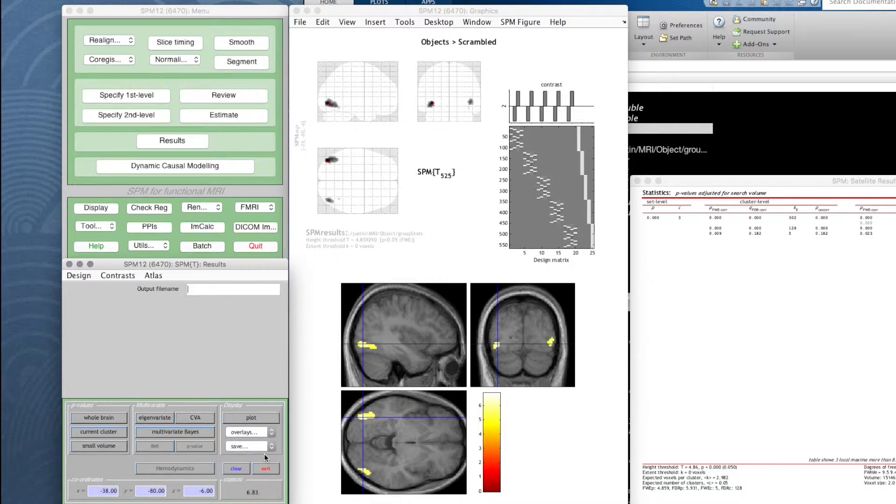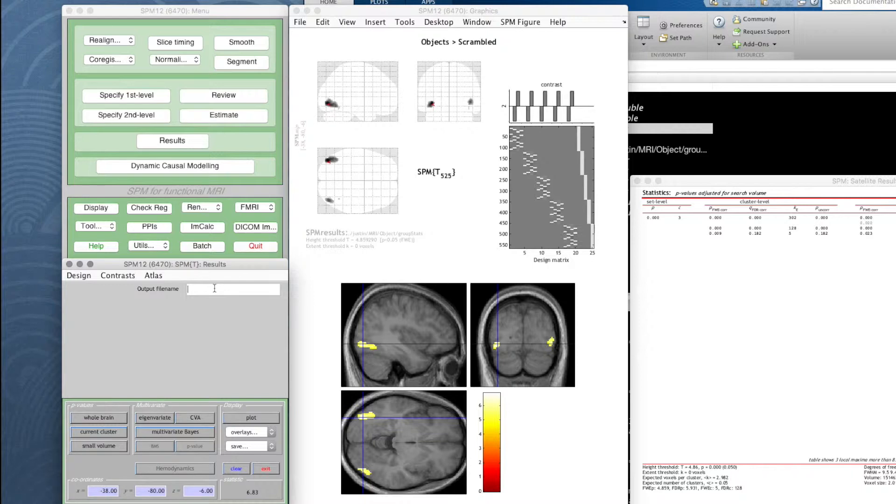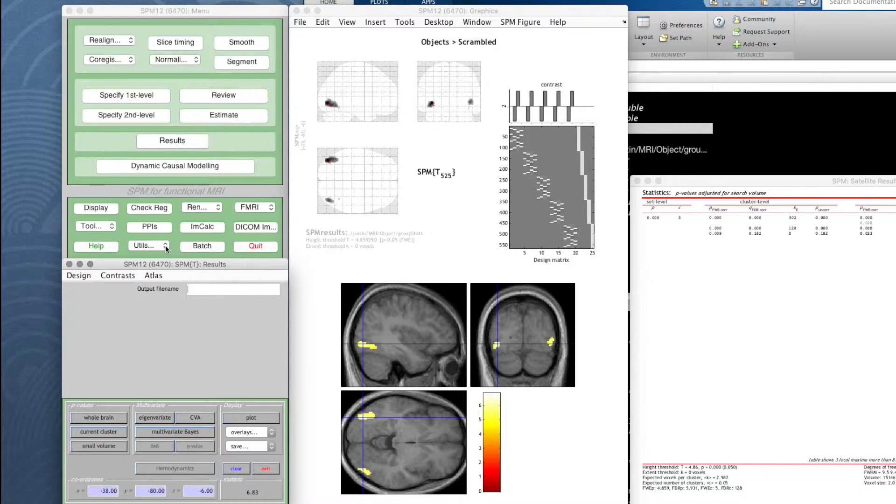Let's save the thresholded SPM for objects minus scrambled. It asks us for an output file name. It will save this as a 3D file, a nifty file dot nii in the current working directory. Always a good idea to know what that is. I will save this and this is the objects, I'm just going to write minus scramble just so I know exactly what it is.